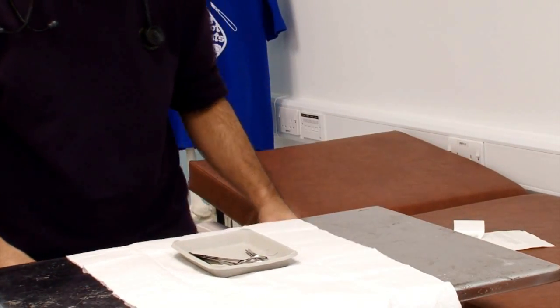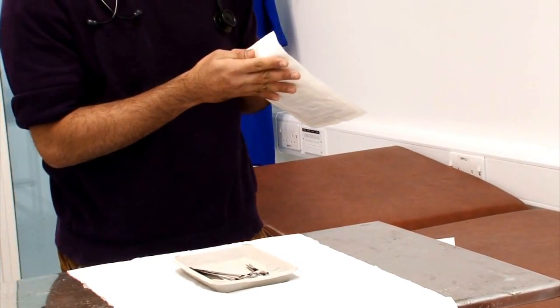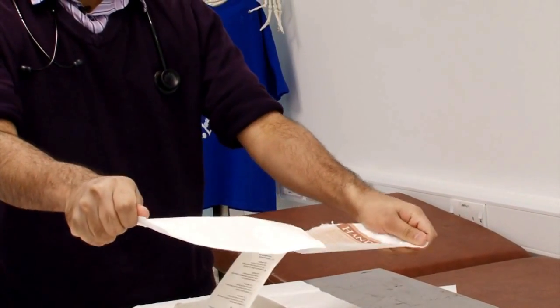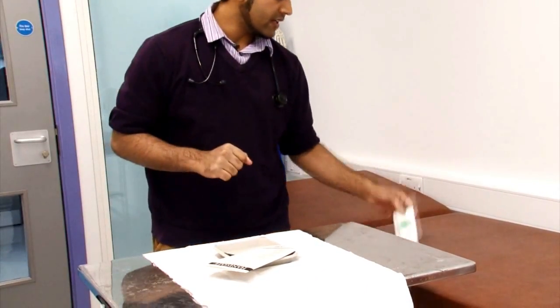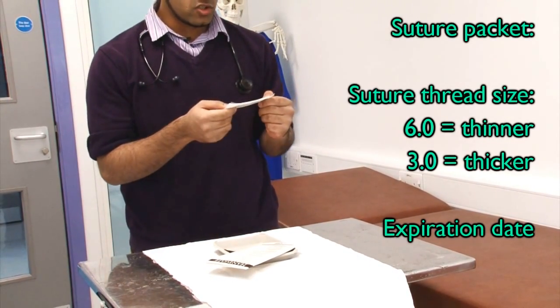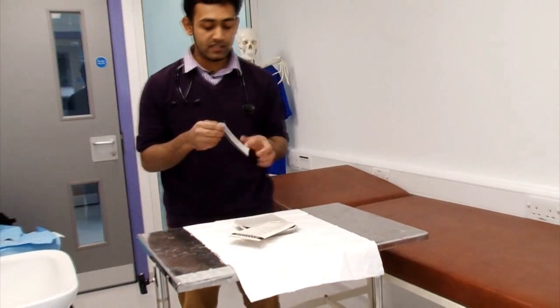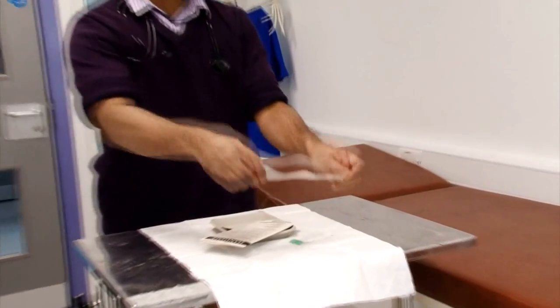Open the pack as such, then open the gloves onto the sterile area. Make sure you get the right size gloves. Then open your sutures — make sure it's the right size, check the gauge of the needles, and also check the expiry date. This one's in date. Open the sutures onto the sterile field like that.